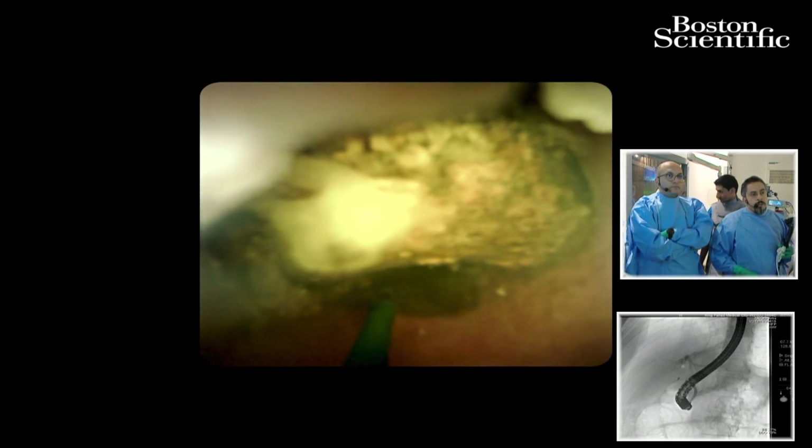It's very difficult to keep the cholangioscope stable in the bile duct, especially while introducing the probe. The other trick is the elevator has to be down. And sometimes you want to make sure that the duodenoscope itself, as well as the cholangioscope, are not locked, so they are not stiff, preventing the passage of the probe.